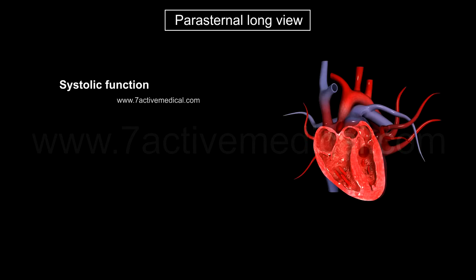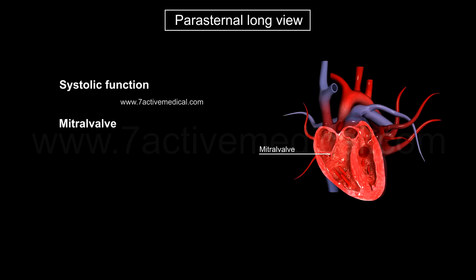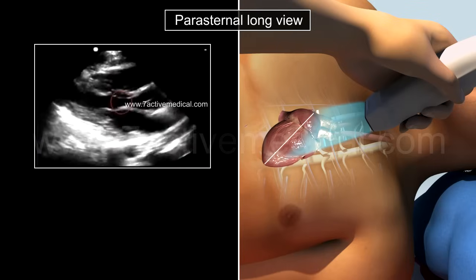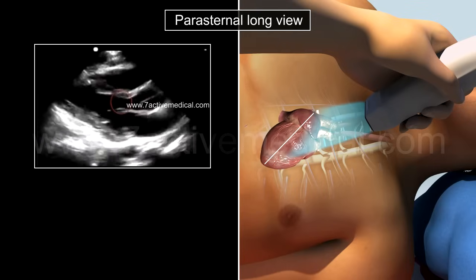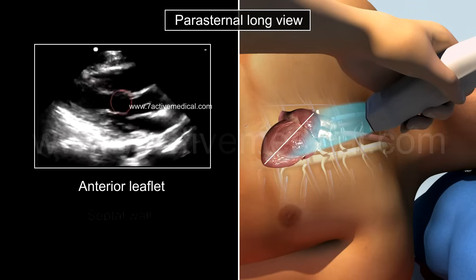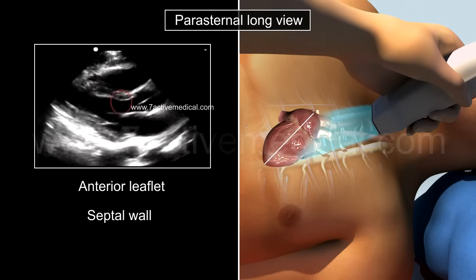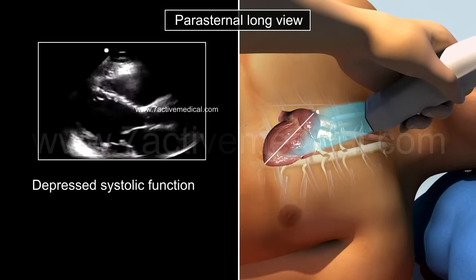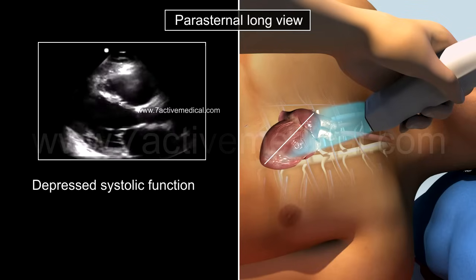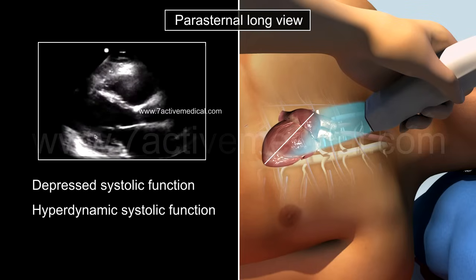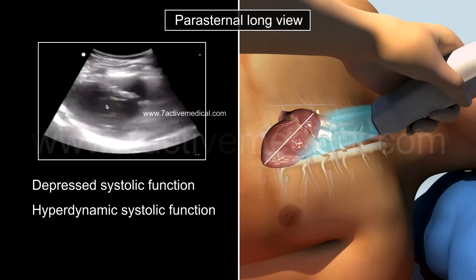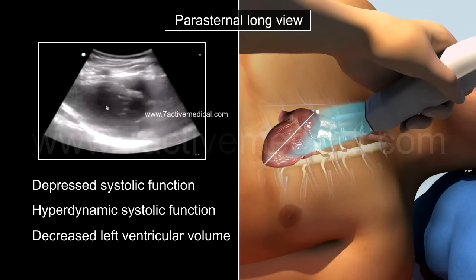Estimating systolic function is done by first identifying the mitral valve with the anterior leaflet and the interventricular septum. In normal systolic function, the anterior leaflet is seen to slap against the septal wall, as shown in the imaging. Depressed systolic function would result in the slowing of the slapping action, while a hyperdynamic systolic function would result in the rapidity of the slapping action, often leading to a decreased left ventricular volume.